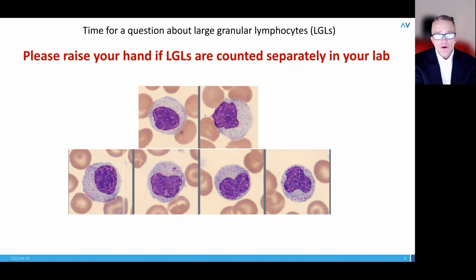It's interesting, but we wanted to ask that question because there were a significant number of participants that actually classified LGLs in the category called LGL, which is perfectly fine. Many labs put them in the normal lymphocyte category, and I'll talk about that in just a moment.